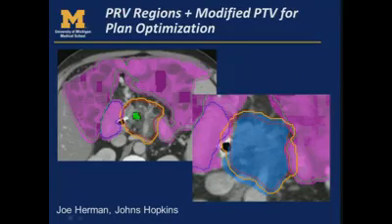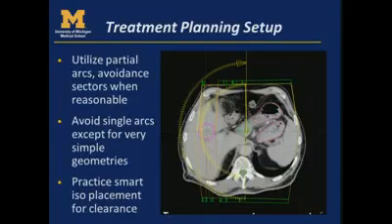So you may need to have a little bit of a margin around your bowel structures and abdominal OARs. And then even for treatment planning, to create somewhat of a modified PTV where you're pulling the PTV region away from the OAR since you know that they're maybe not the top priority. But you do have to be careful because you don't want to give no dose to that area. You may want to ensure that you're at least giving the tolerance dose to that structure in your plan.